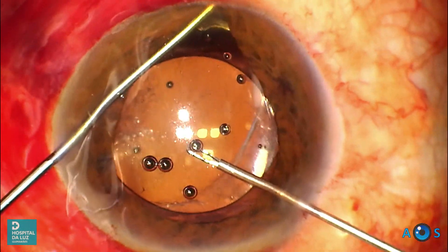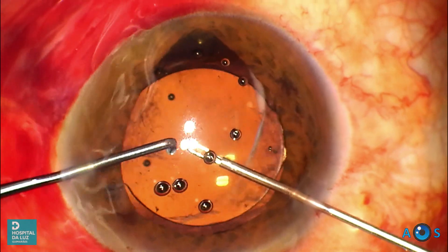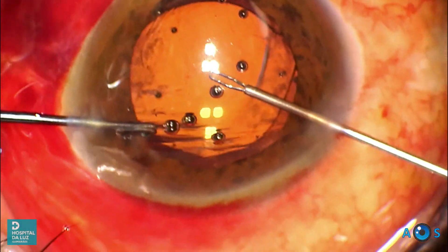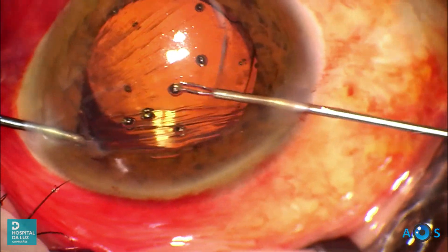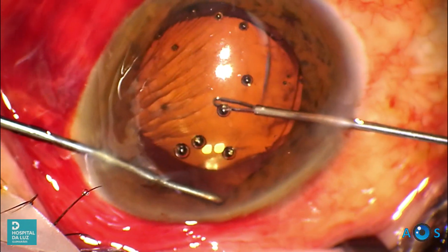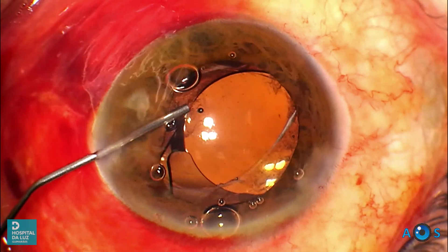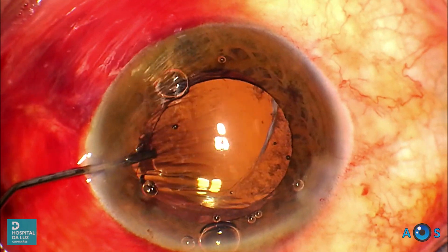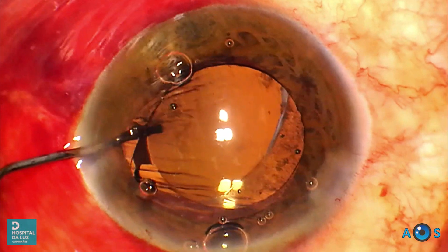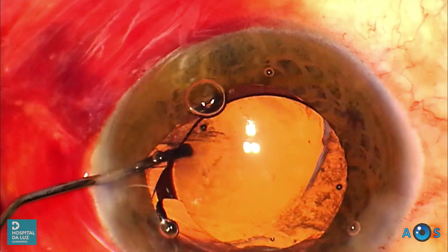The second instrument is used again to peek underneath the iris while assessing zonular integrity. The bag is fully stable and the IOL centered.